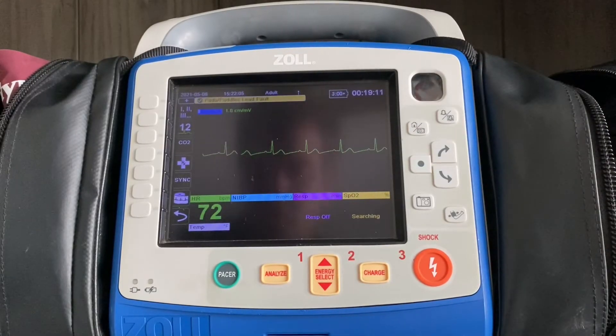This is a quick review on how to acquire and transmit a 12-lead on the Zoll X Series.